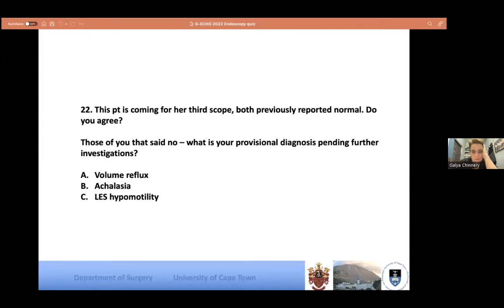Okay, let's see. Yeah, thank you. If you go down an esophagus and you see puddles of saliva, but no obvious stricturing or anything distally, please, you must think of a dysmotility of the esophagus, and you have to look at either doing a barium swallow if you can, even better a manometry, but there is here definitely dilatation and puddling.